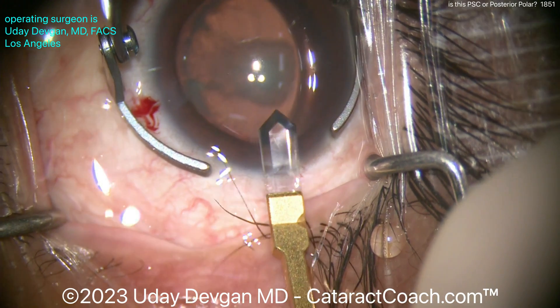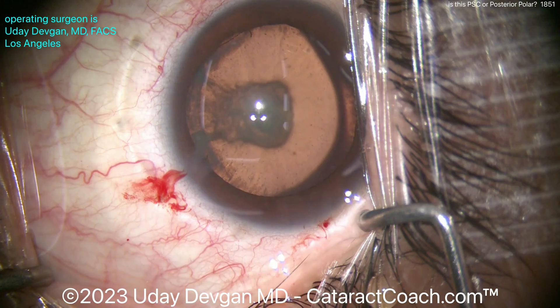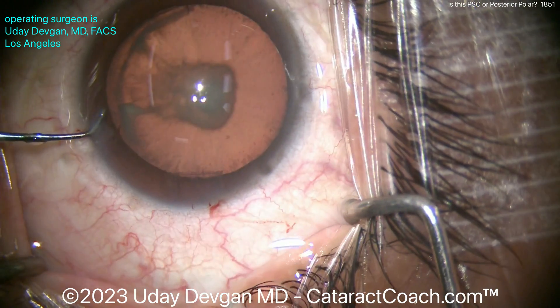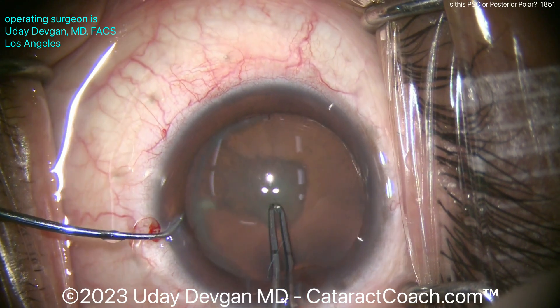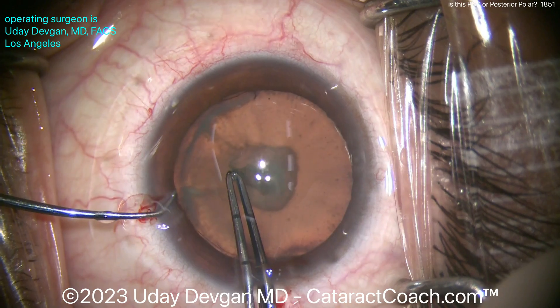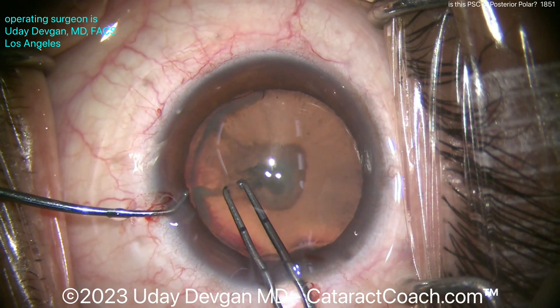I know the eyelashes are in the field — thanks for not saying anything. So what are we going to do now? We've got to make the rhexis here. The patient is being non-cooperative, but that's okay — we can just hold the eye with the chopper. I definitely want a nice clean 5mm rhexis, because if this is a posterior polar and there is an issue with the posterior capsule, we may end up putting a sulcus lens and getting an optic capture.